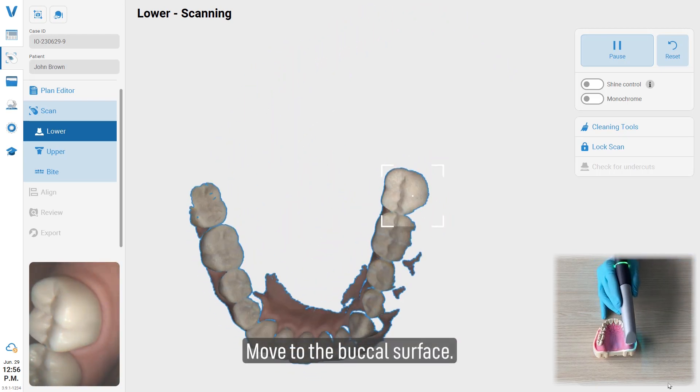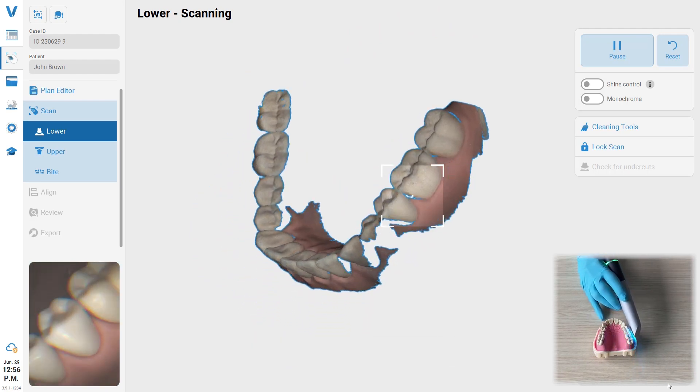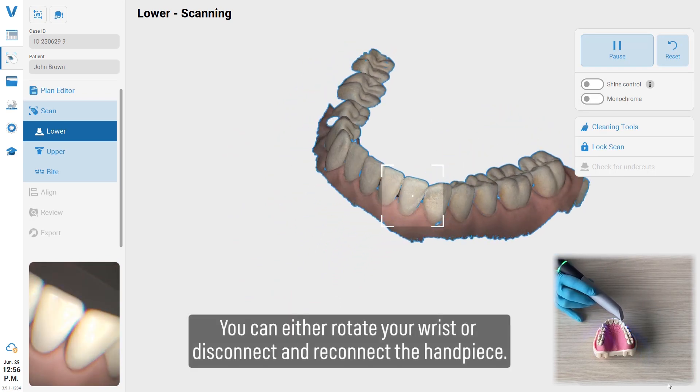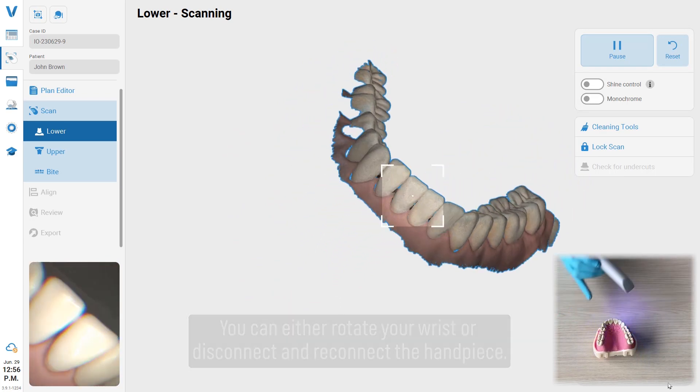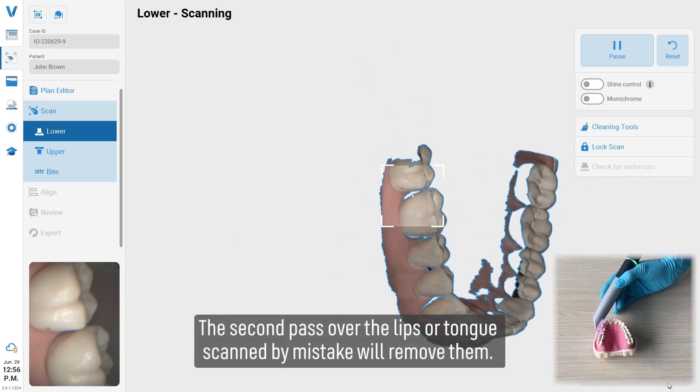Move to the buccal surface. You can either rotate your wrist or disconnect and reconnect the handpiece. A second pass over the lips or tongue scanned by mistake will remove them.